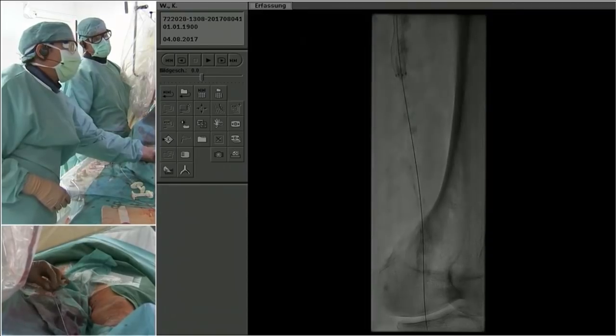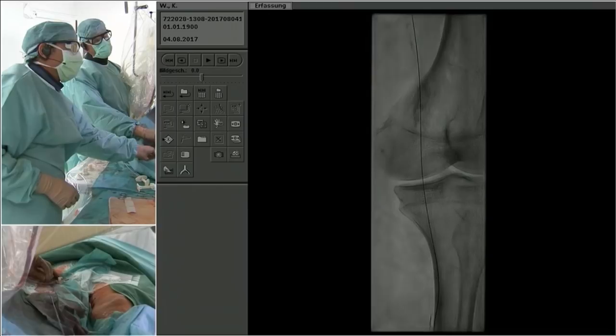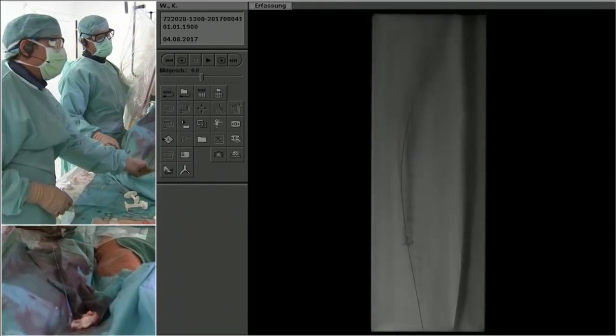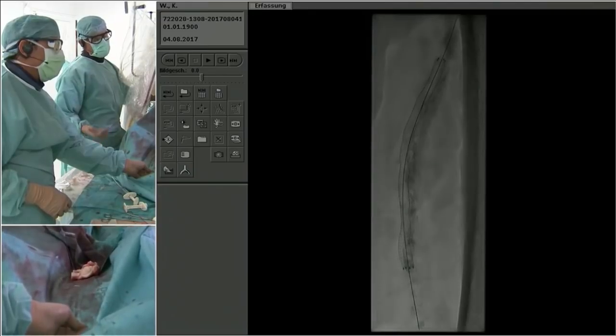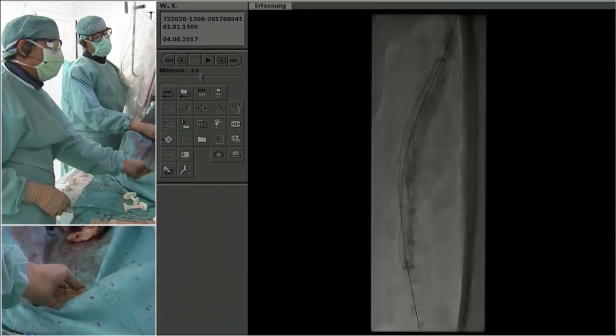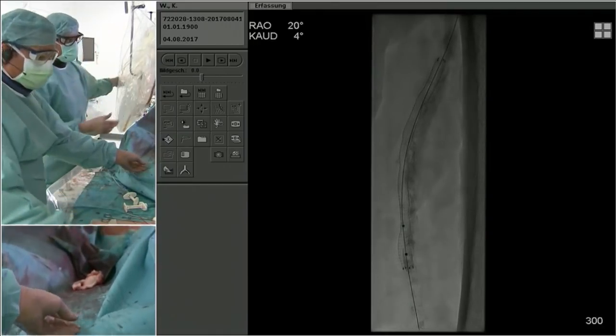Well, that's a great question. We still see some segmental residual stenosis, and then we do take a Supera in. Well, we will decide after you dilate this, Andrej. The Viabahn may have enough. Sorry? You're going to dilate this now, so we'll see after that.